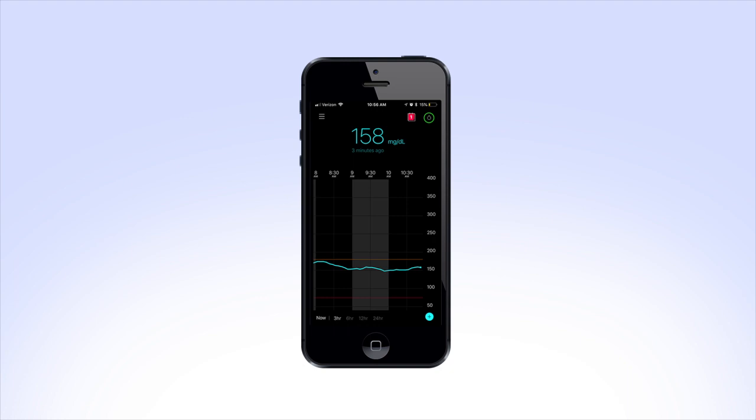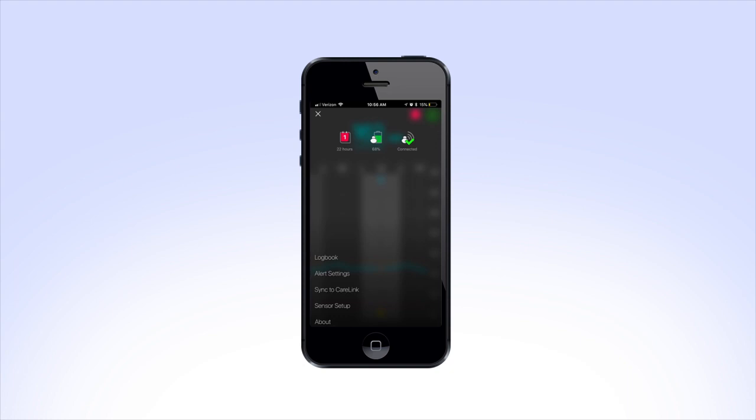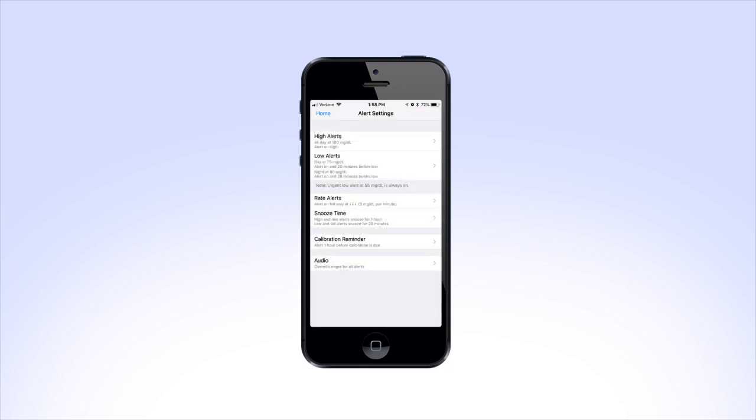Let's start by accessing the Alert Settings menu. Begin by tapping on the menu icon in the top left corner of your home screen. Tap on Alert Settings. Here you'll see a list of the different settings ranging from high alerts to audio settings.